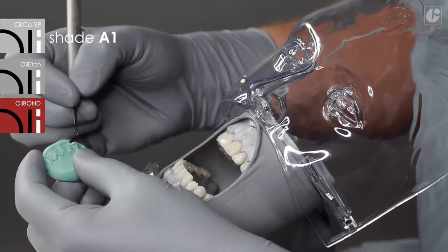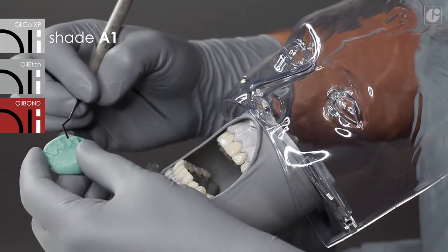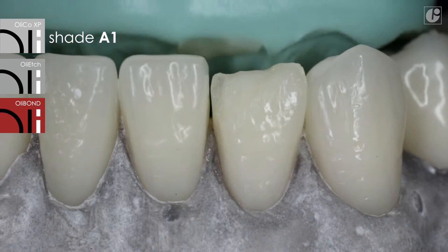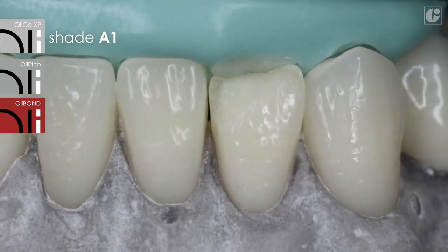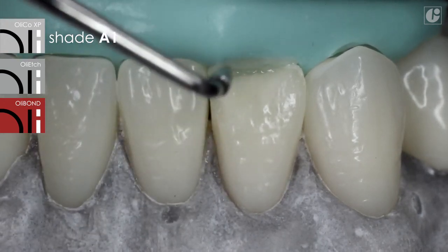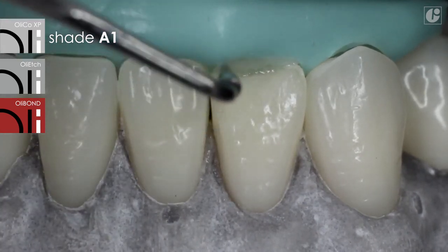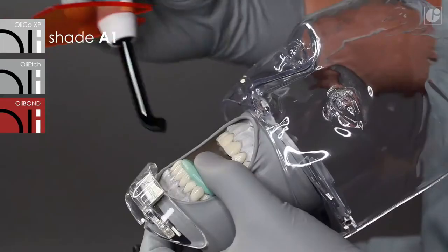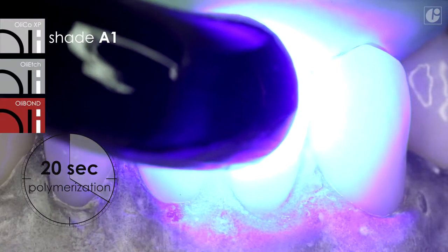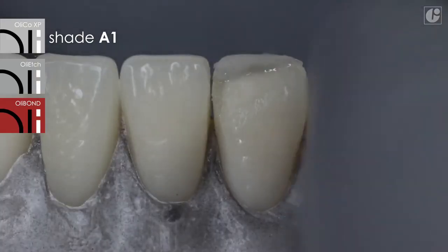The first shade used was A1 Enamel Hue, which is used as the first layer of the reconstructed tooth from the lingual side. The consistency of OliCo XP allows for very precise work both in the silicone index and within the prepared tissues. This composite material does not stick to tools, which significantly improves the comfort of work. The maximum thickness of a single layer is 2 mm, and each layer should be cured separately. For light colors like A1, the recommended curing time is 20 seconds; darker colors should be cured for about 30 seconds.